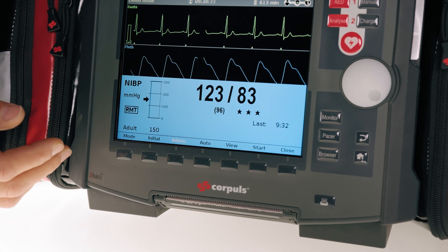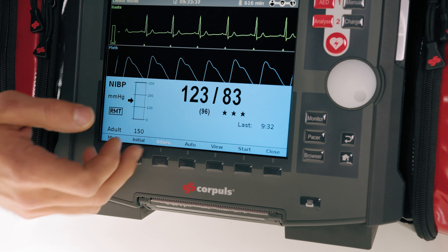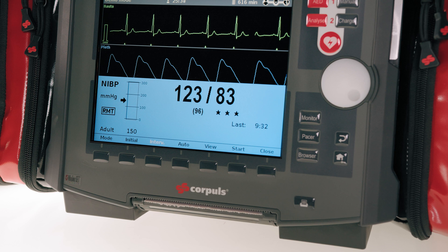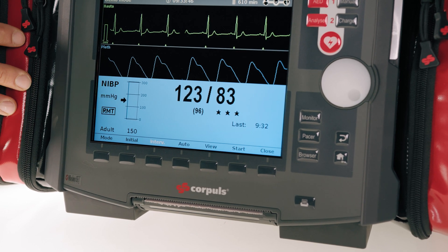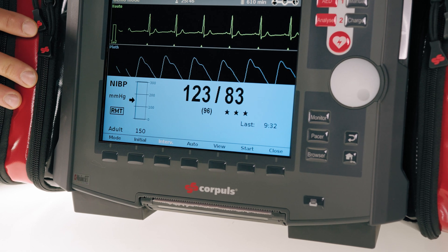The device has now measured the blood pressure and displays it together with the calculated mean value. Here we can also see three stars — this is a kind of measurement quality index. It's algorithm-based. The more stars, the more valid the measurement is from a technical point of view. At zero to one stars, we recommend repeating the measurement if possible.